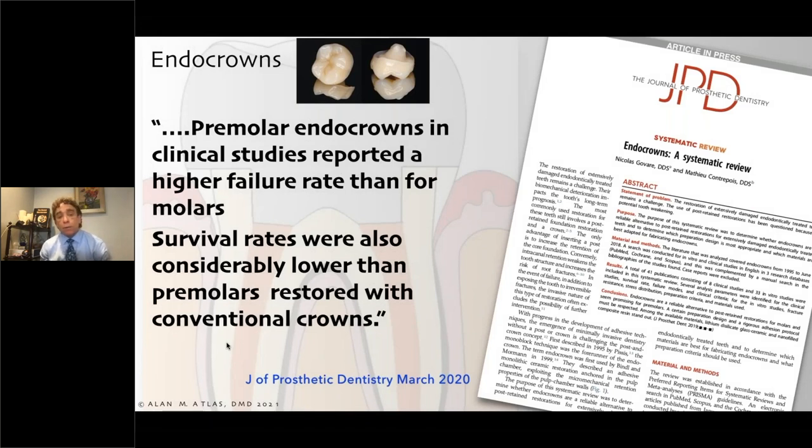So we see that maybe for molars there is a higher success rate, but we know doing these things on molars and cementing them in with adhesive cementation, you need good isolation, you need rubber dam utilization. It's far more technique sensitive. The question is, is this the best way to do it?